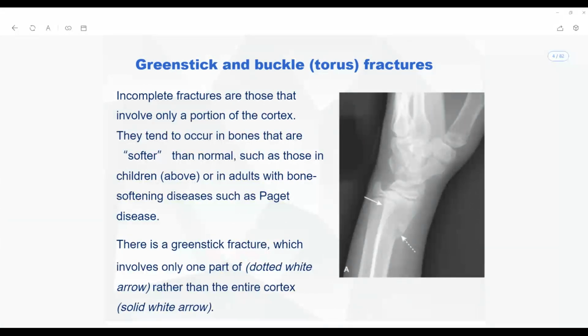You have to look at them in different views. We'll talk about it in fractures. This is always necessary when you are analyzing a problem related to the musculoskeletal system, especially fractures. You have to prescribe in multiple views. The rule is prescribe in multiple views, and the views are generally AP view, lateral view, and axial view.